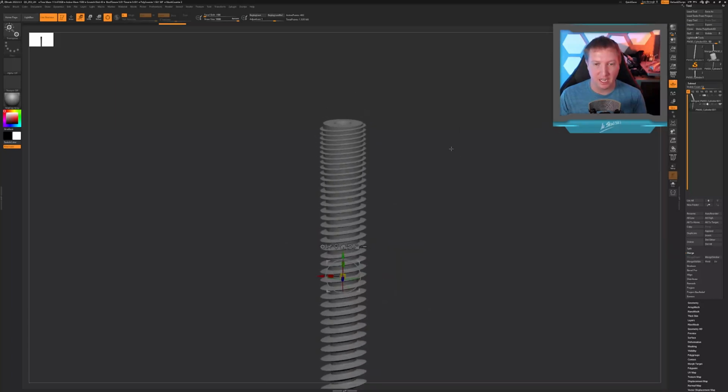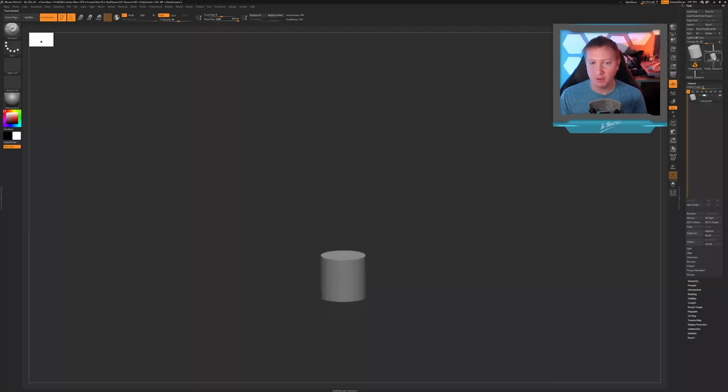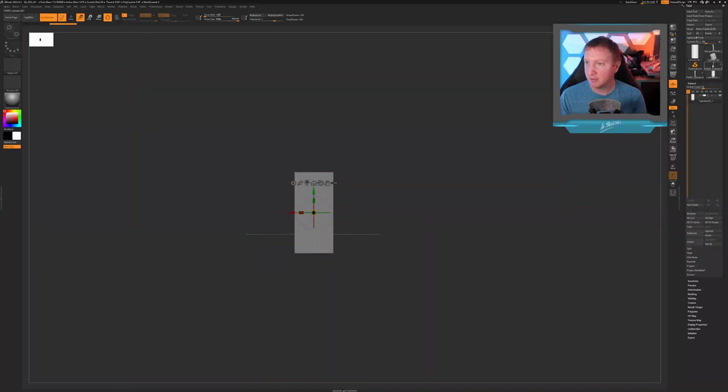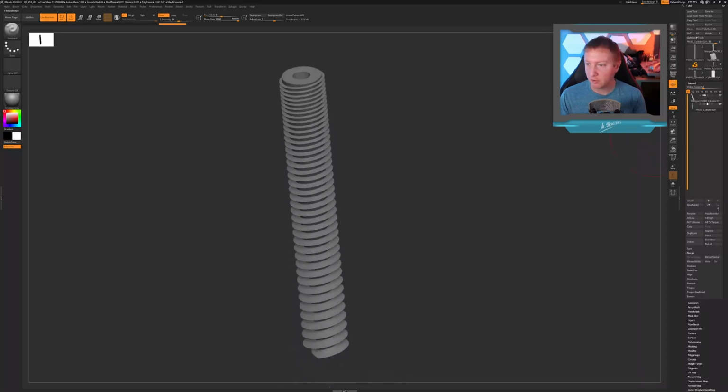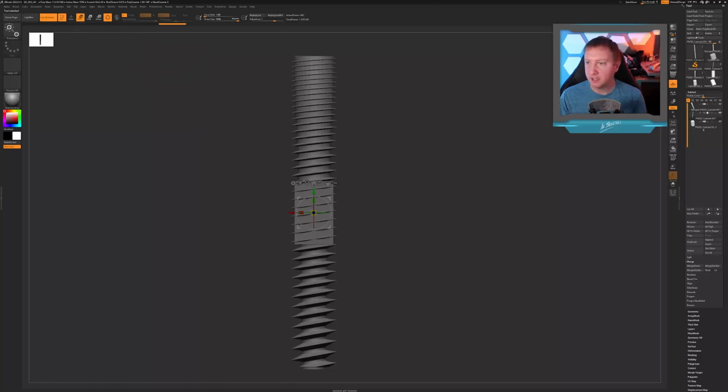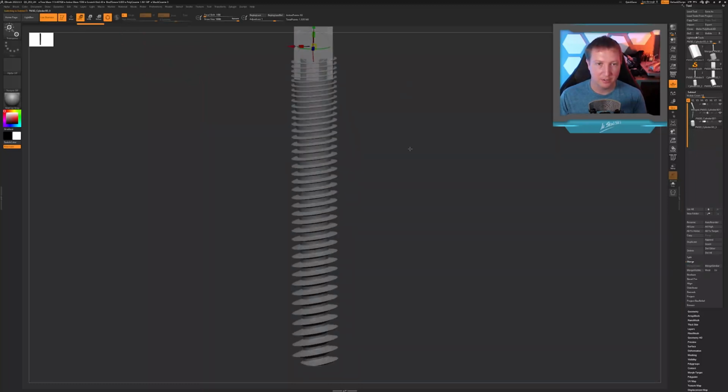Now I need to add the slot for the hex bit. So I'm going to come up here to my cylinder 3D, and come down here to my initialize menu. I'm going to change the horizontal divisions to 6, and you can see that that gives us this nice little hexagon shape. I want to make this just a little bit longer, so I have some room to work with. Let's come back up here to our screw, and I'm going to add that. All right, so there's our hexagon, and now I need to move that hexagon up here to the top of the screw.